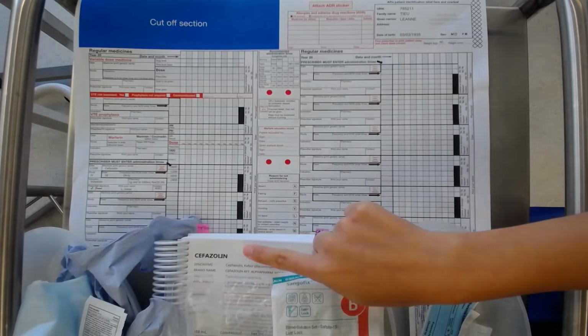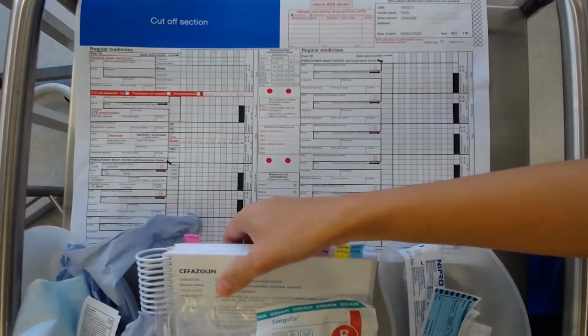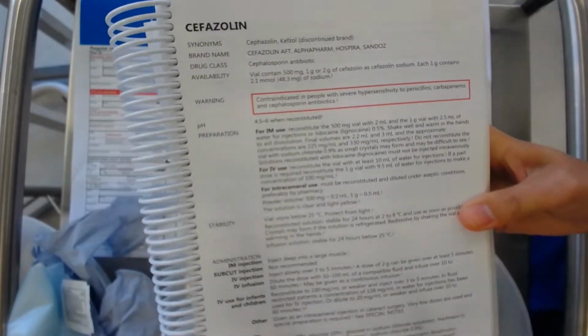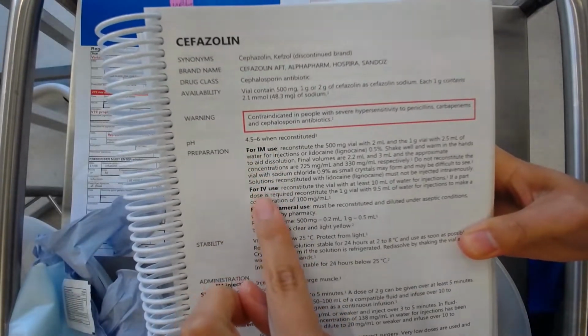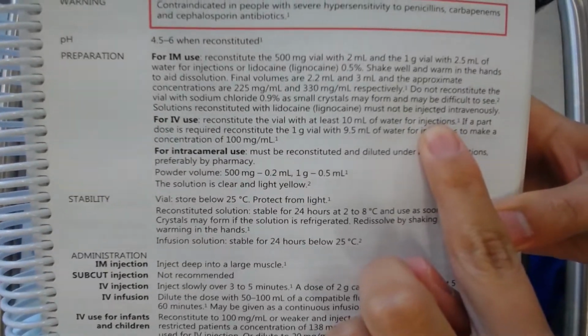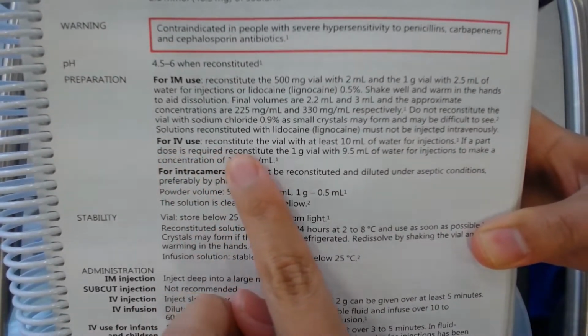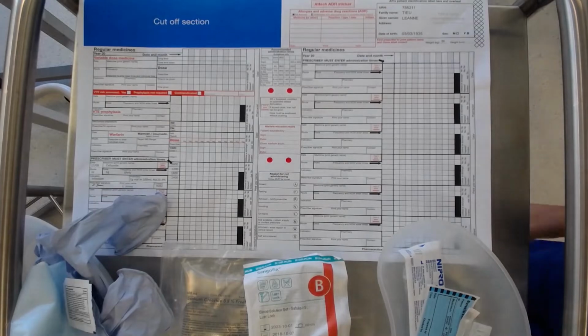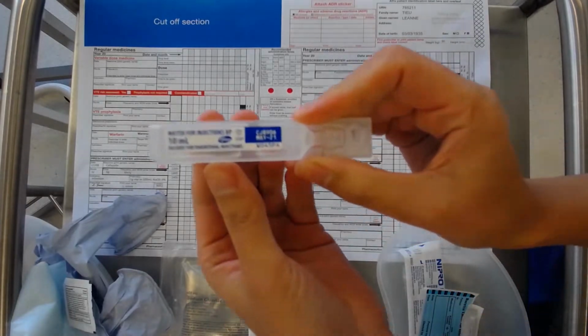Here is the Australian Injectable Drugs Handbook. If I turn to Kefazoline, it'll say for IV use, preparation for IV use. Reconstitute the vial with at least 10 milliliters of water for injections. That's my diluent. I'm checking my diluent, water for injection, 10 milliliters.